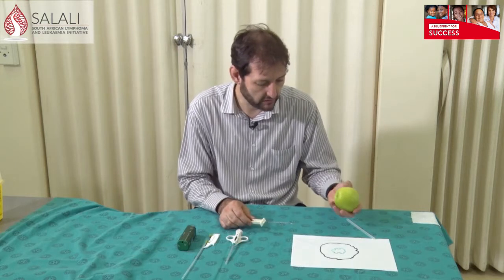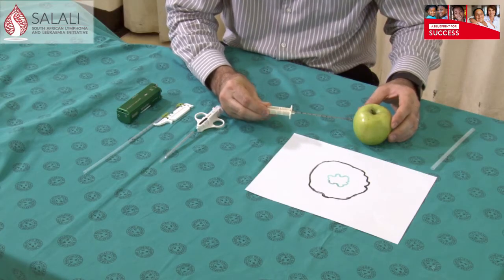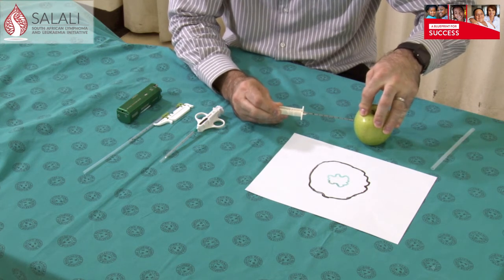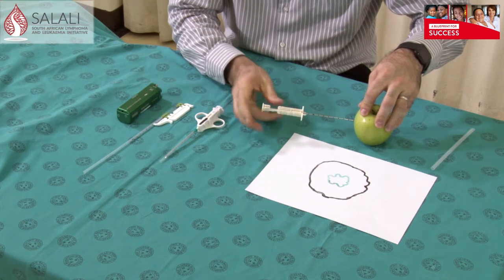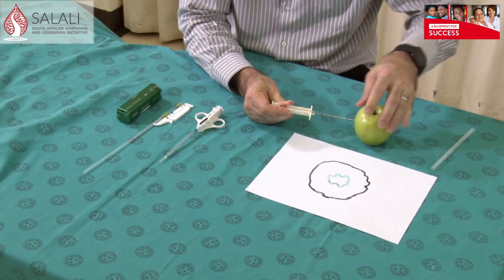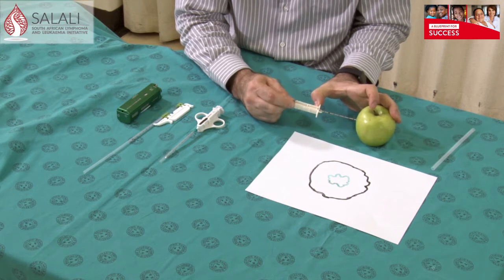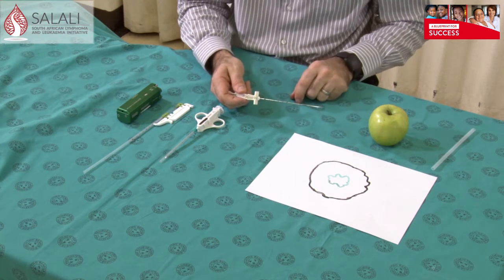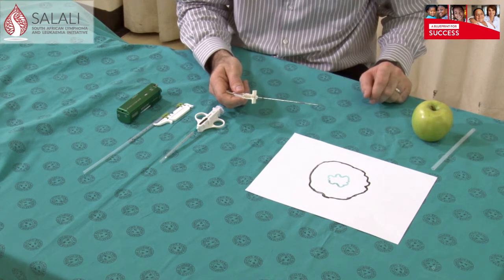Let me illustrate this on something else — let's use an apple as an example. First you go in through the skin, feel where your lump is. Imagine that I'm hitting my lump now, then I'm going to go slightly inwards with the back of the needle. You advance forward into your lump, then slide the front forward to close the biopsy cavity, then extract the needle, open up, and you should have your biopsy inside the biopsy cavity, which can be sent for histology.